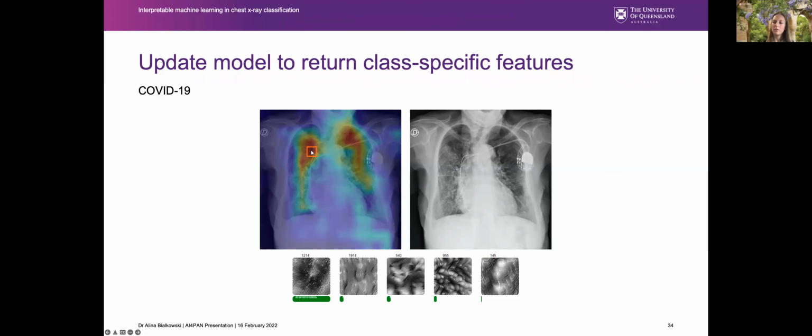I think some streams of research are looking more into symbolic AI, so things that you can actually quantify. They'll do segmentation. They know this is a heart because that's what the segmentation model says. They know this part is the region that corresponds to the lungs. There is some research in that space. I think a lot of people that have done this work, myself included, did it because maybe it's easy.